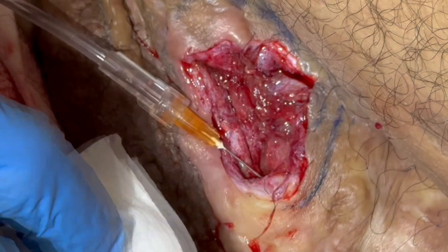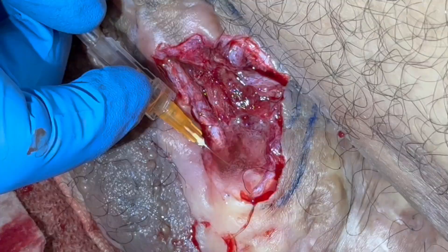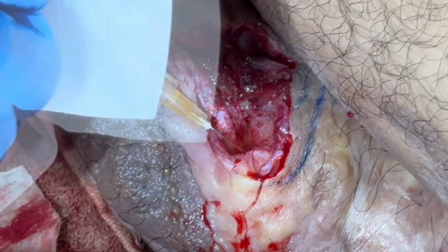Postoperative care is going to include a sitz bath with a dilute Clorox solution because it's still close to his anus, and he'll wash this similarly after each defecation, then apply gentamicin ointment four times daily. This patient has had very severe scrotal Hidradenitis Suppurativa for many years. We treated today a very acute abscess — present for only five days and progressing rapidly. We used tumescent epinephrine, lidocaine, ertapenem, and triamcinolone local anesthesia to treat this and provide anesthesia and vasoconstriction.